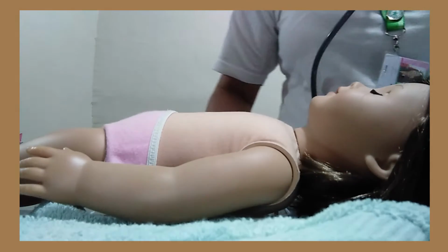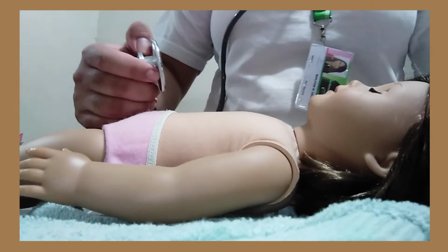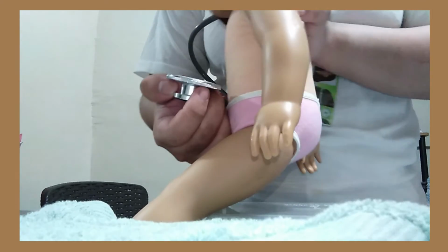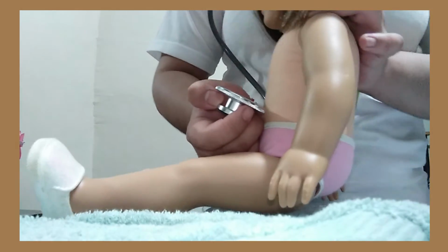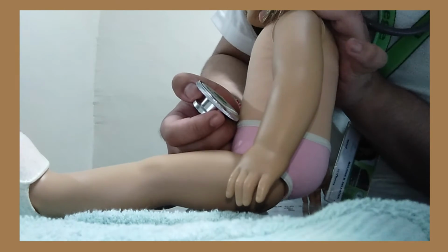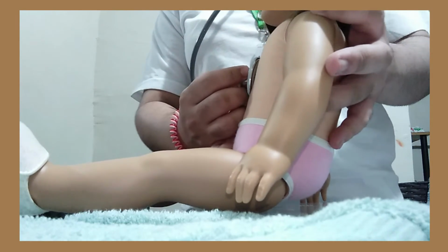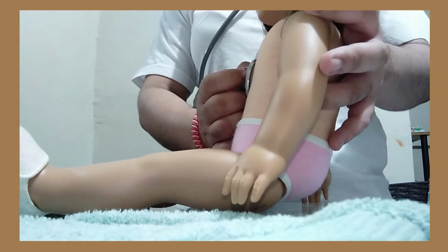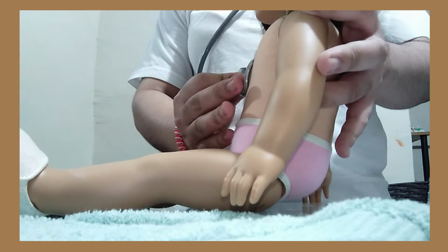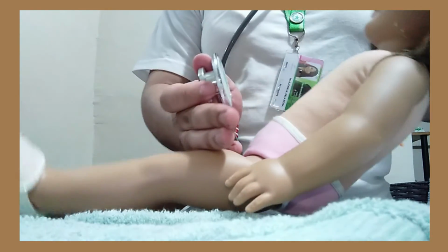Okay. So now for the aortic regurgitation, we're going to be asking the patient to sit forward, because earlier she was in the supine position. Then we're going to be listening over the left sternal border with the diaphragm in full expiration. Okay? So ma'am, please take a deep breath in. Deep breath out, all the way, and hold it. Okay, very good.